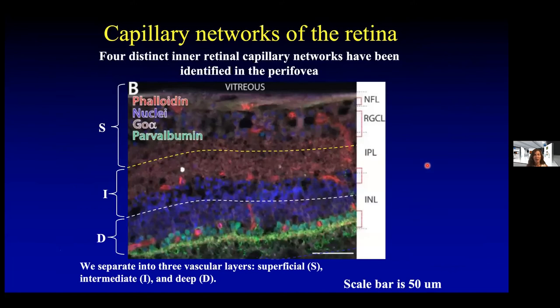One of the benefits of OCT-A angiography is that it allows us to segment the retinal layers so we can see the distinct capillary networks around the fovea, and this was not possible with dye-based fluorescein angiography.